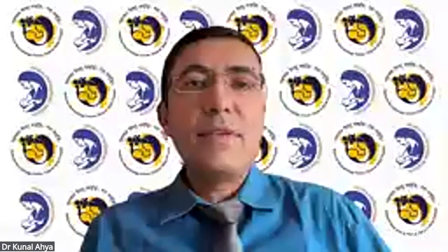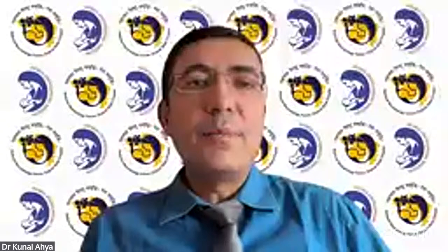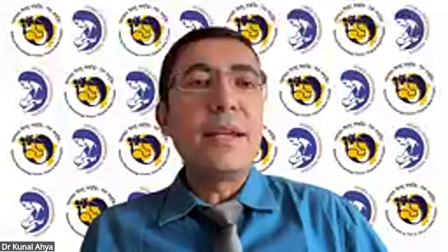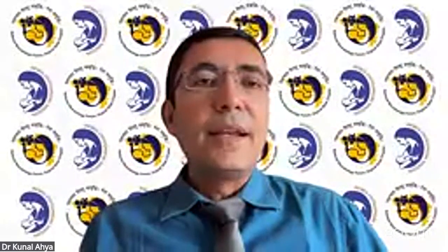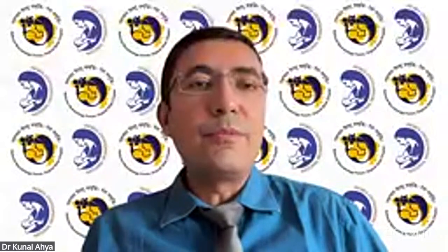It is our great pleasure that we are continuing with our Neonatal Pathshala series, in which we have a special series of POCUS. Today is our 21st session on POCUS. Initially we had covered the echocardiography part, and now we are covering neonatal cranial ultrasound. Previously we heard two topics regarding cranial ultrasound, the anatomy and the normal views. And now we will see the live demo, how we actually perform this.